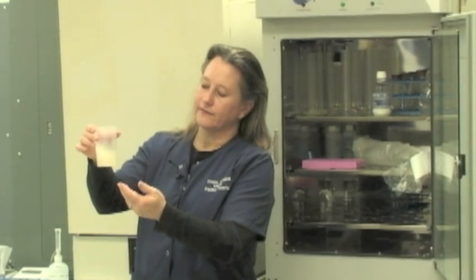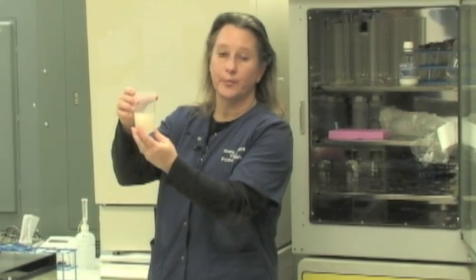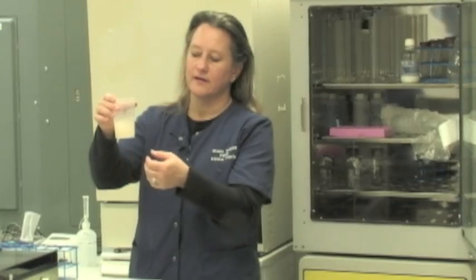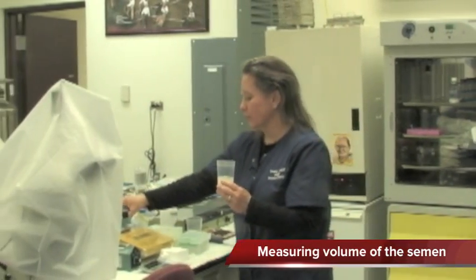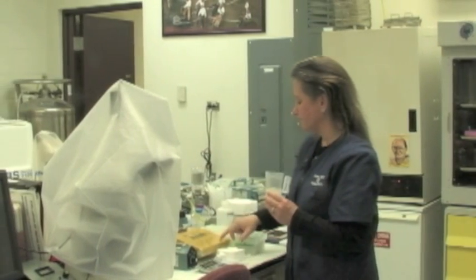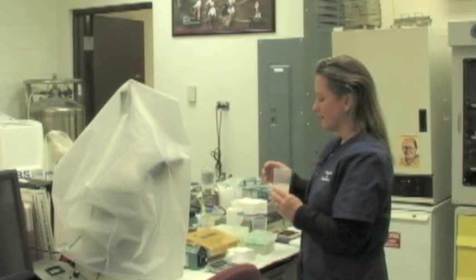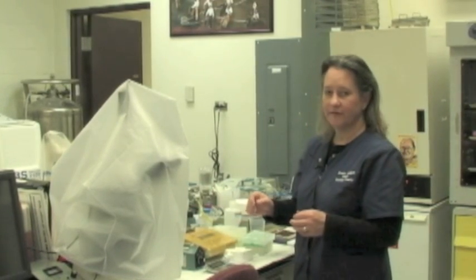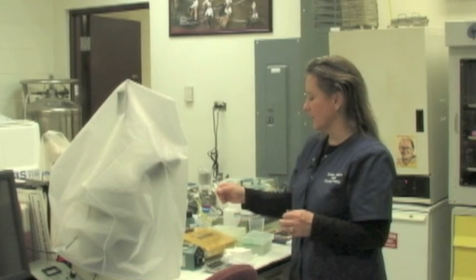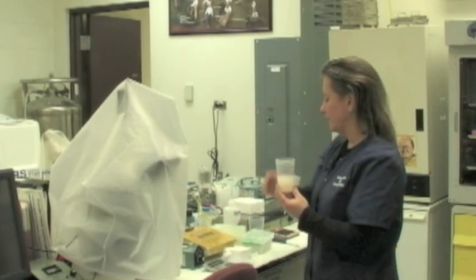As you can see, this is kind of yellow in appearance and you can't see through it or read through it — we call that opaque — so it contains a lot of sperm. One of the things we do to measure volume is we actually weigh the specimen. We take an empty specimen cup, tare out its weight, and then place the specimen cup with the semen on the scale to get an accurate volume. Our volume today is 101 mils of semen.